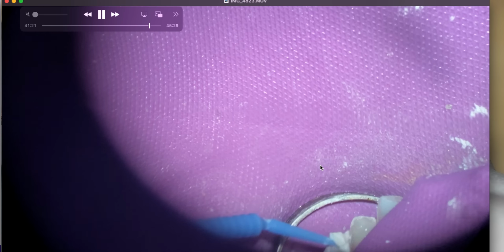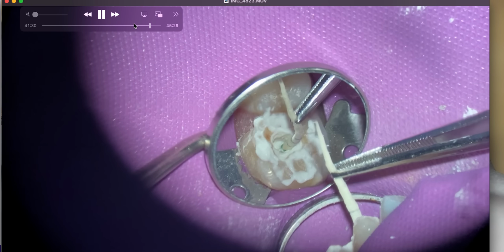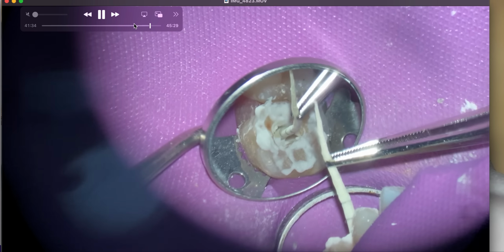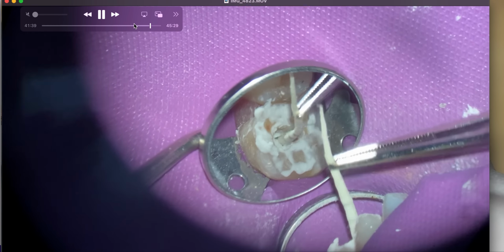So that's her fumbling around because she put too much. It was too liquidy, if that's a word. There was too much liquid in there, so we're going to slowly dry it out. A quick way to dry it is she's just fumbling around there. What I'm saying is that I like to empower her to do as many things as possible, because dental assisting can sometimes be, I imagine, fairly mundane and routine. But she mixed it perfect. She's an amazing dental assistant.